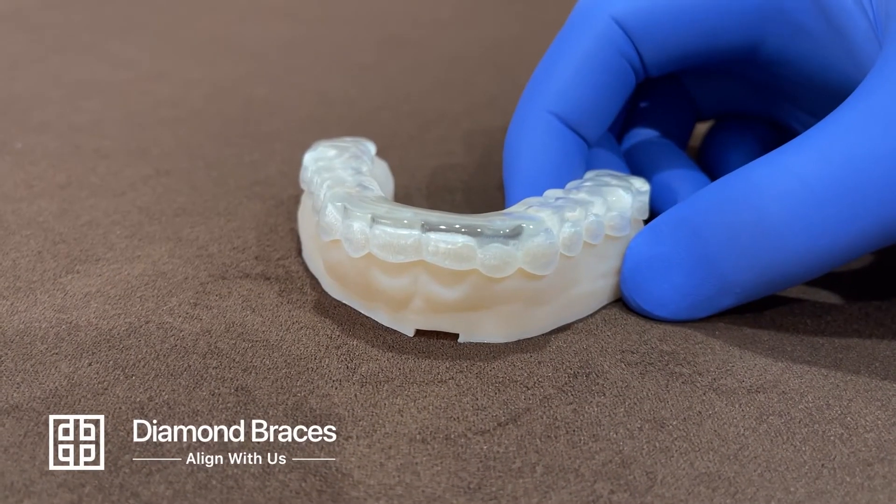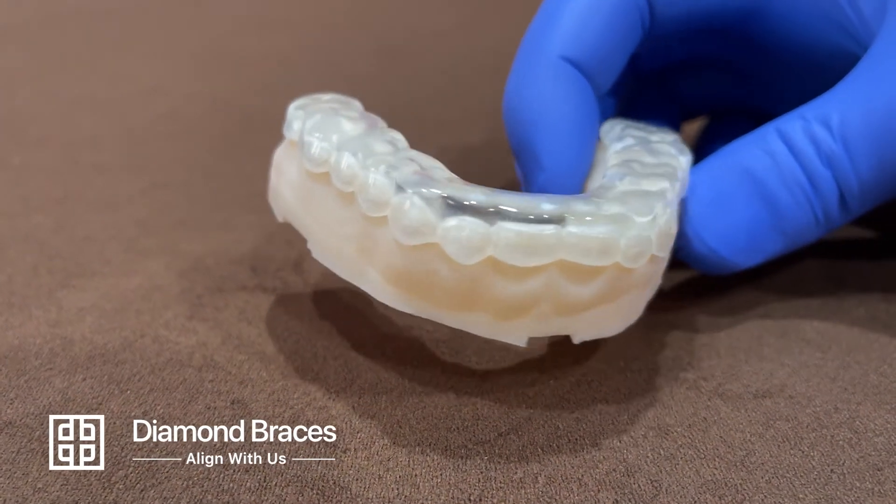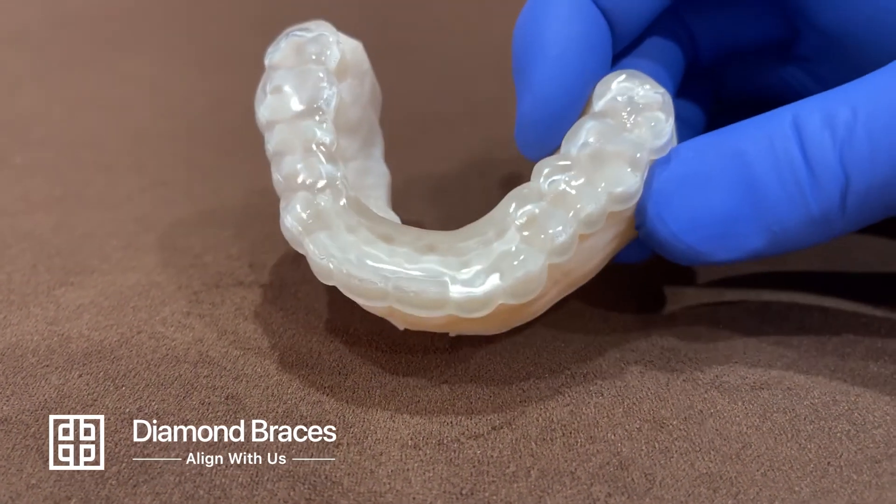After the night guard is 3D printed and polished, it is ready to use. The finished appliance does not require additional adjustments, which makes pickup at the office fast and easy.